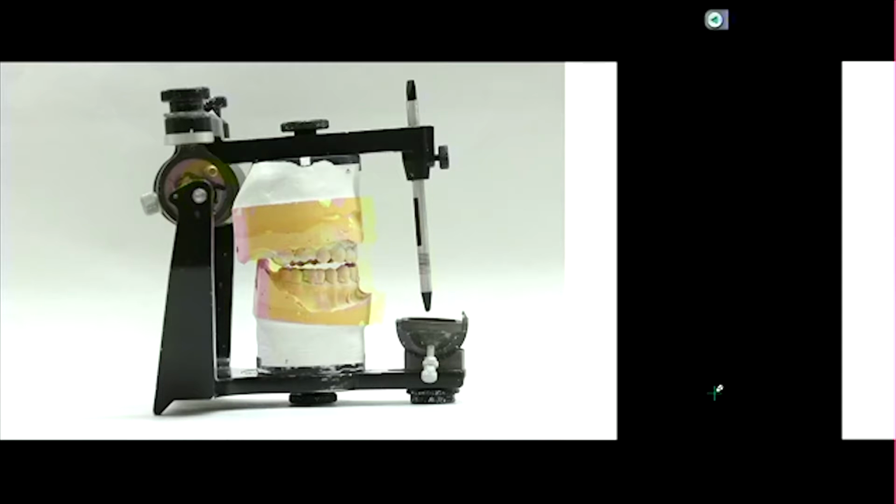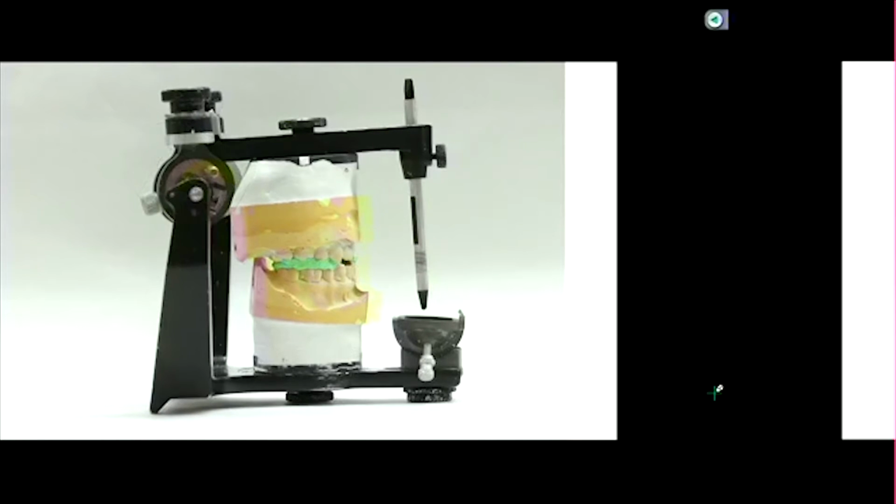Okay? So you've done that in the patient's mouth. And what do you notice about the posterior teeth there? You got space. Okay? So what we're going to do is, remember that bite wedge that we had? So we're going to squirt some in the back and say, hold your teeth in that edge-to-edge position, and we'll let that polymerize or set. Okay? So now we got a bite registration or a jaw relation record of the patient when they are in an edge-to-edge position.